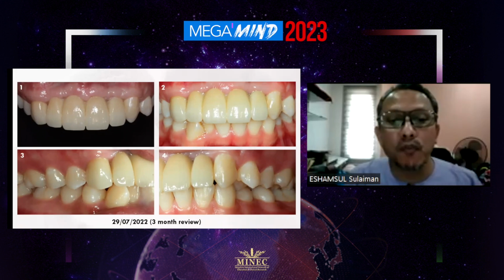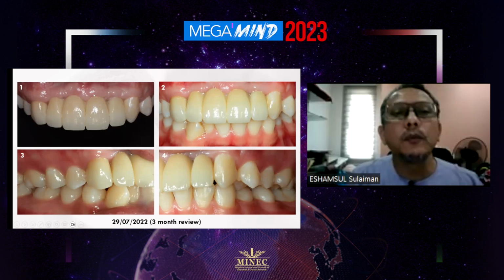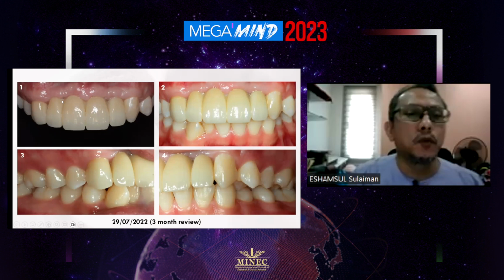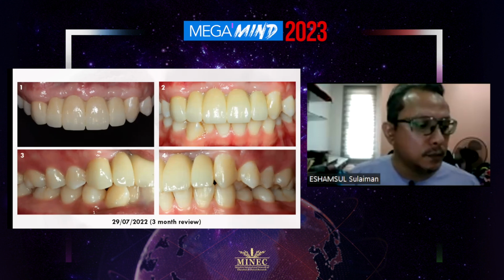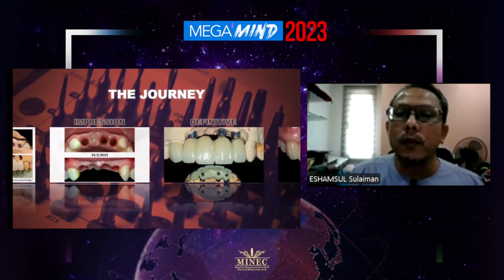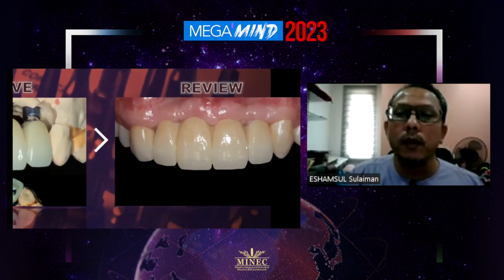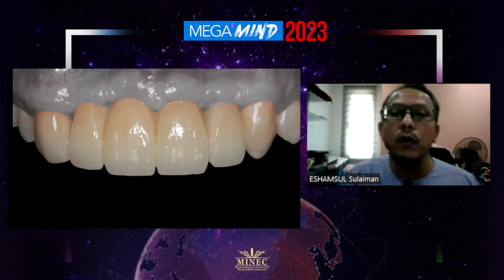So here is about the 3 months review. You can see the soft tissue is already more matured and stable, although a little bit of the papilla I would wish to be there. But nevertheless, you can see the band of keratinized tissue is well formed, both stability as well as aesthetic. So now you can see the review, the soft tissue and the hard tissue both being stable, and the aesthetic was also established in this case.